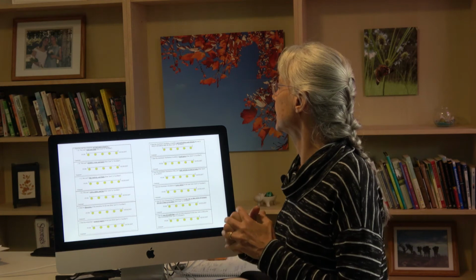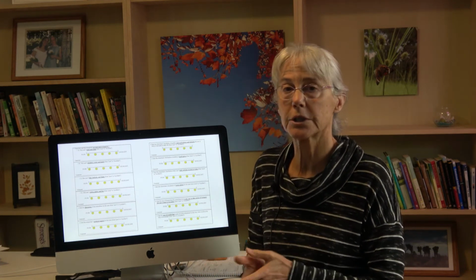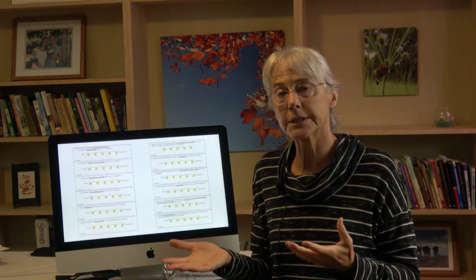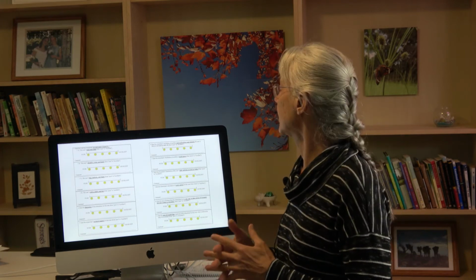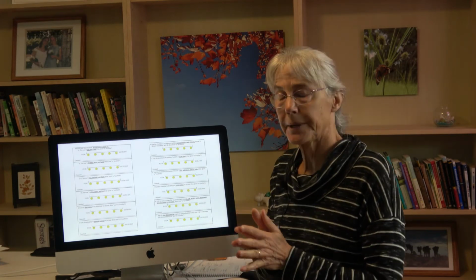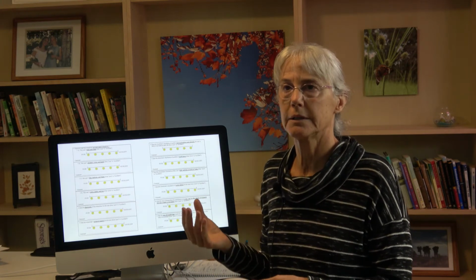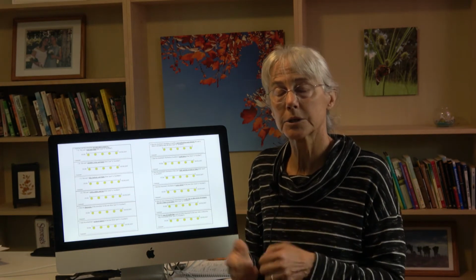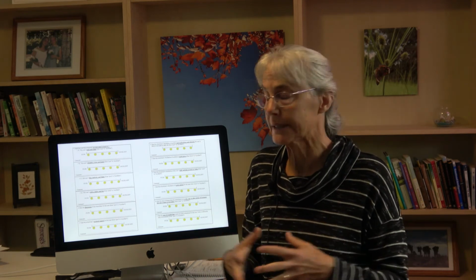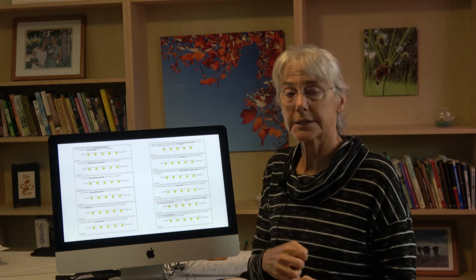Rate this wheelchair's facilitation of mobility across all surfaces and obstacles this user is likely to encounter. In other words, does it provide mobility on the surfaces they'll encounter outside or wherever? Rate the wheelchair's facilitation of mobility in small spaces. We found that this needed different wheelchair characteristics than rolling on rough surfaces. So we made it separately because also many people live in tiny houses and the workspaces or schools may be very space limited. Rate the wheelchair's facilitation of this user's daily activities at desks and tables.